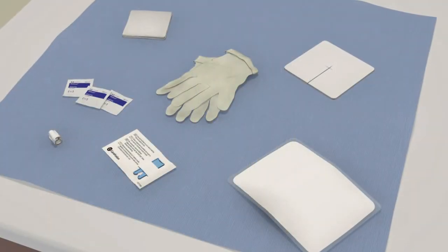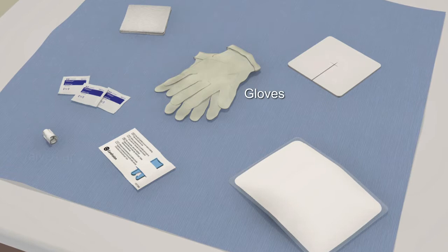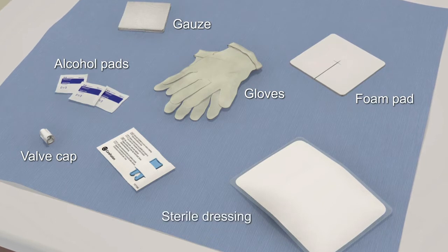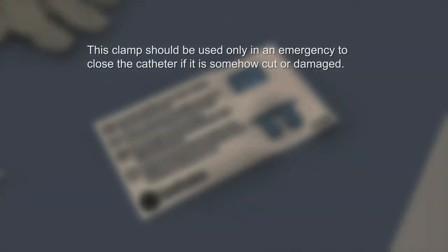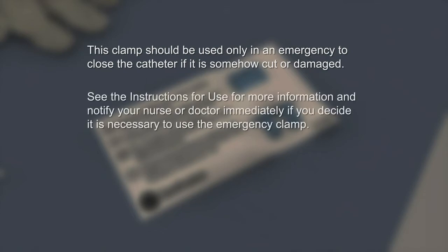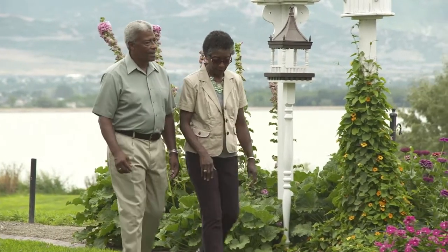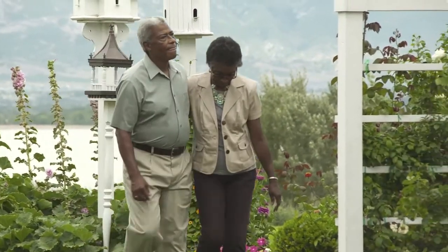The PleurX bottles come in a drainage kit that is easy to use. The kit contains the sterile items you need to drain at home, including gloves, a new valve cap for the catheter, alcohol pads, gauze, a foam pad, and a sterile dressing. The kit also contains a blue emergency slide clamp. This clamp should be used only in an emergency to close the catheter if it is somehow cut or damaged. See the instructions for use for more information and notify your nurse or doctor immediately if you decide it is necessary to use the emergency clamp. You should drain as directed by your doctor, usually every 1 to 2 days. Do not change frequency or drain more fluid than your doctor has recommended without first consulting your doctor.